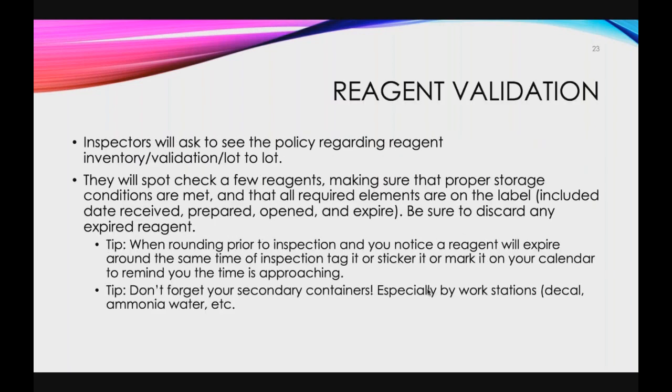Reagent validation is our next topic. Inspectors will ask to see the policy regarding reagent inventory, validation, and lot to lot. Lot to lot's very, very important. And as long as you have a good procedure and a good strategy for doing that, it can be time consuming. But what we do, for example, with antibodies in immuno is when the new antibodies come in, I put it on a spreadsheet, and it's just like a little list, and it's stuck right on the immuno refrigerator.